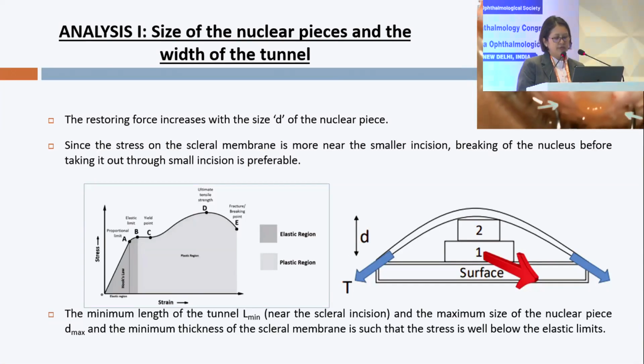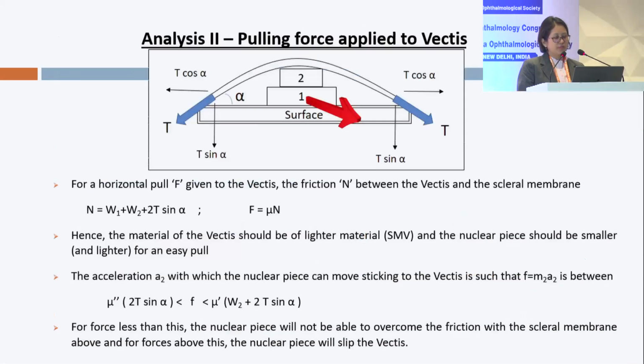We have another paper from the Indian subcontinent by Dr. Ashok Nanda et al., who described the thickness of the scleral tunnel. You need to understand that when it is at least 1/3, or a little more, you will have less stress on the wound. But you cannot increase it to 400 microns and so on, because otherwise you will have a premature entry.